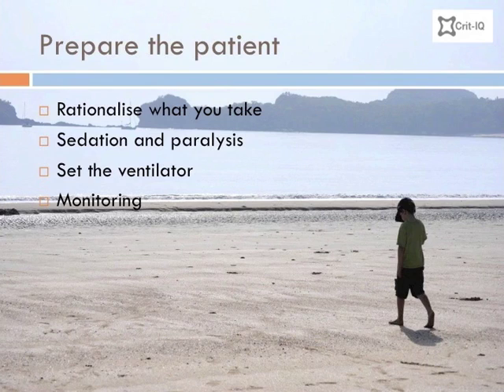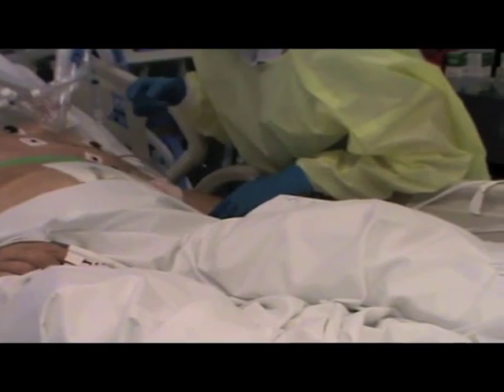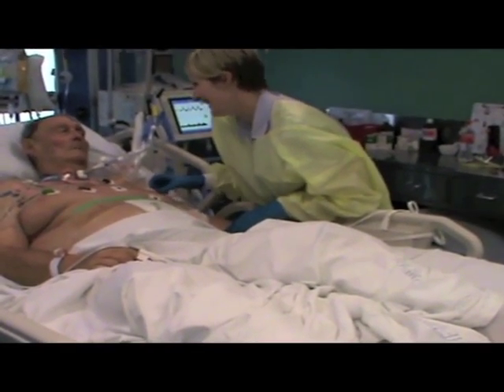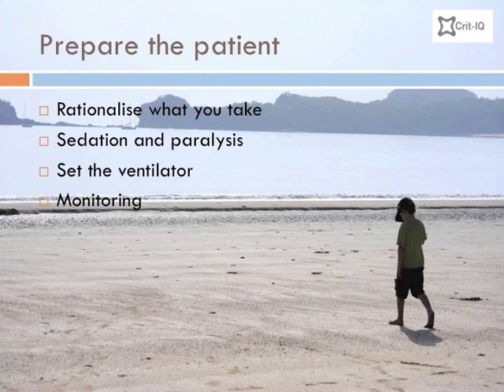If the patient is alert, spend some time explaining what is going to happen, as this may prevent anxiety and distress during the process. It is also prudent to give conscious patients an antiemetic prior to departure, particularly if travelling by vehicle.